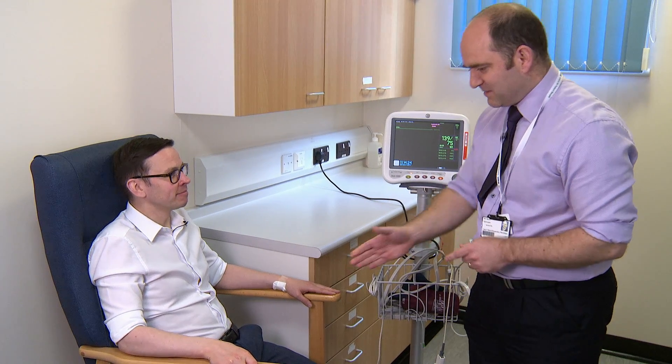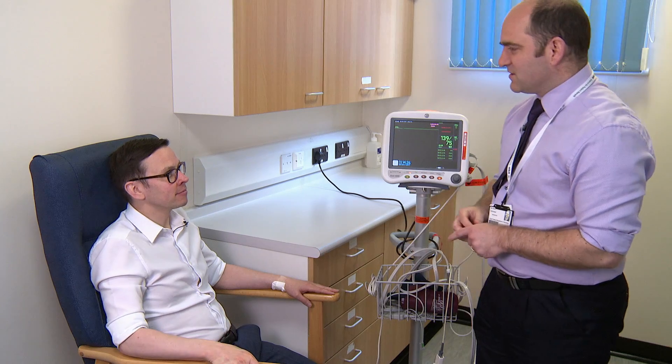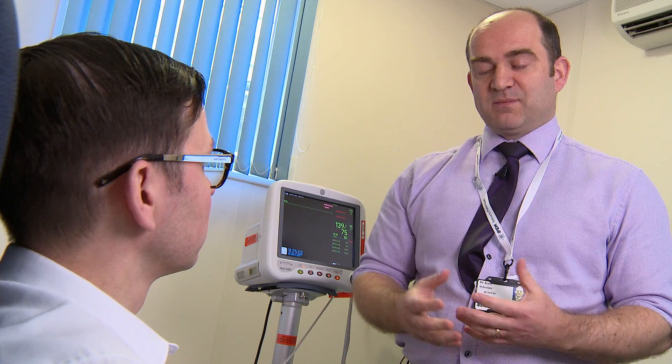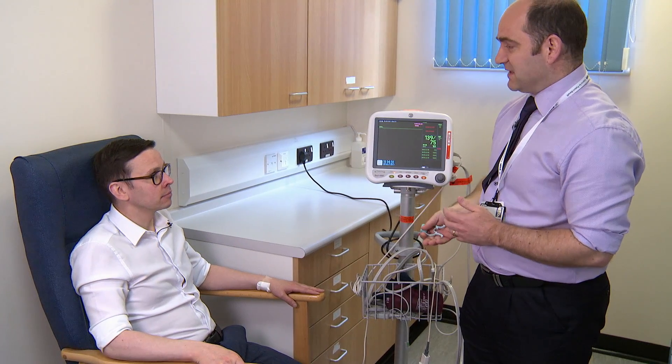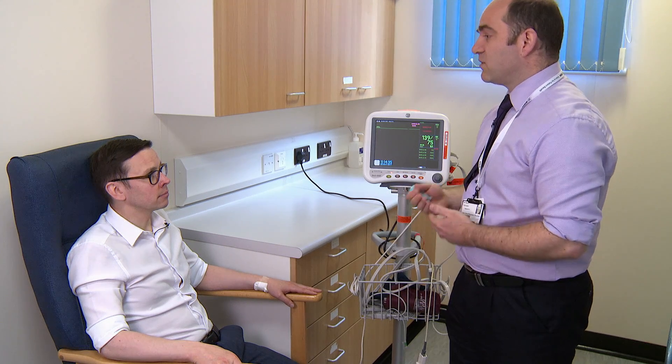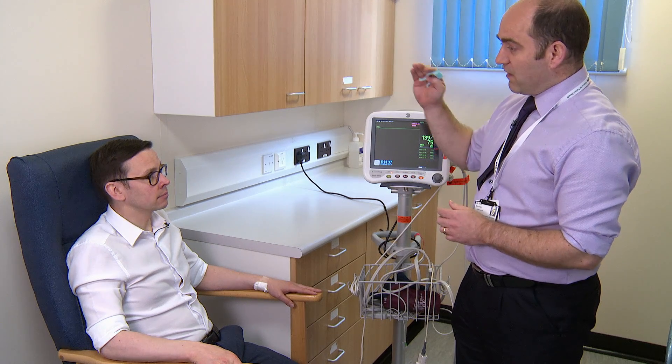Hello Matt, my name is Karl, nice to meet you. Hi Karl. So your doctor has referred you for what we call a fit to fly test. Just to make it clear that the test isn't designed to say whether you can or can't fly — the test is designed to see whether you need to take supplemental oxygen on a flight or not. The aim of the test is to check how you're going to be breathing and what your oxygen levels are going to be doing while you're up in the plane.